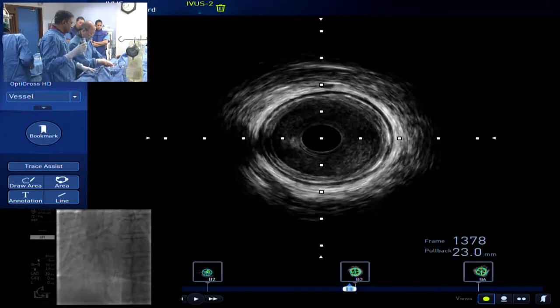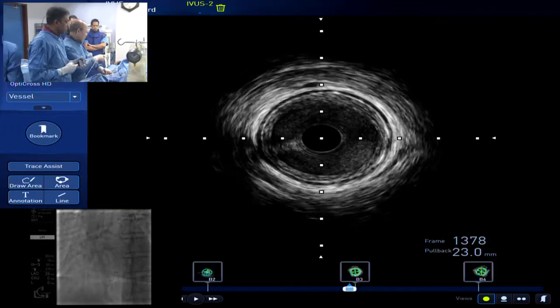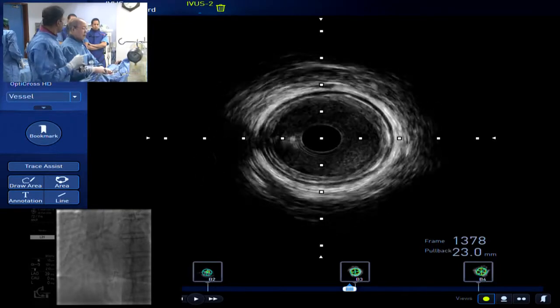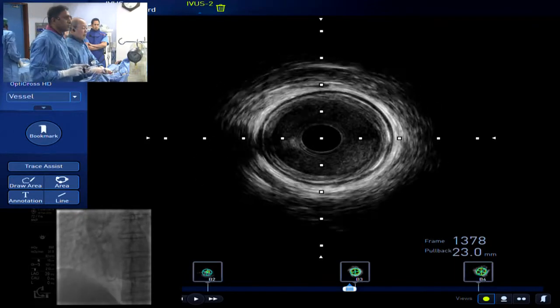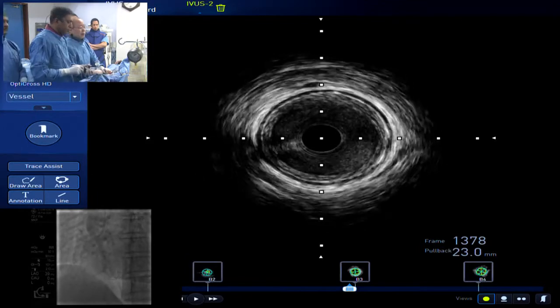While you dilate it, Dr. Sato, you want to engage the guide deeper? Yeah, but cannot do it. Or spasm? Yeah, it's a small radial. Oh, I see. Yeah, the patient developed some spasm. It's a 7 French, all right? Yeah. Okay. Okay. Go. 16.